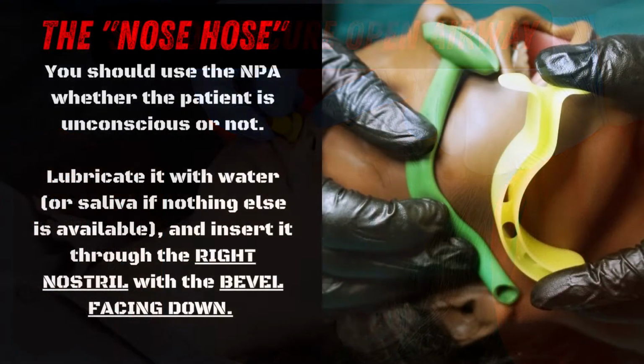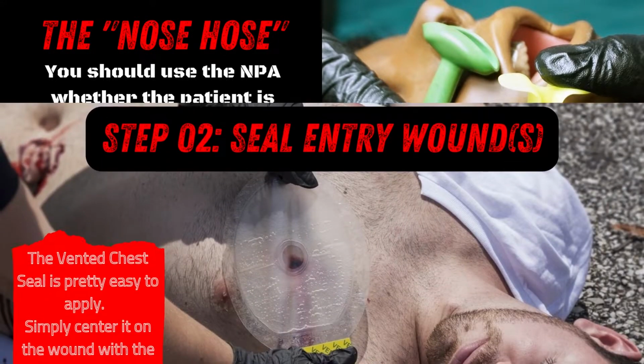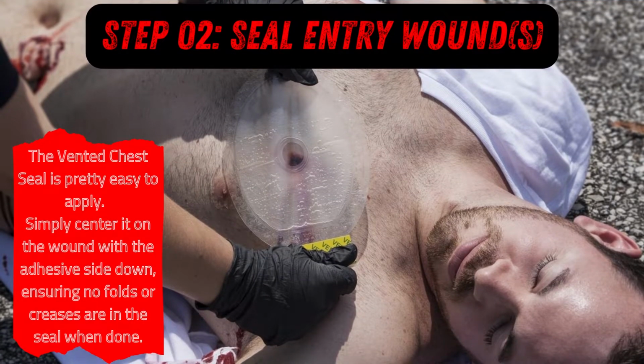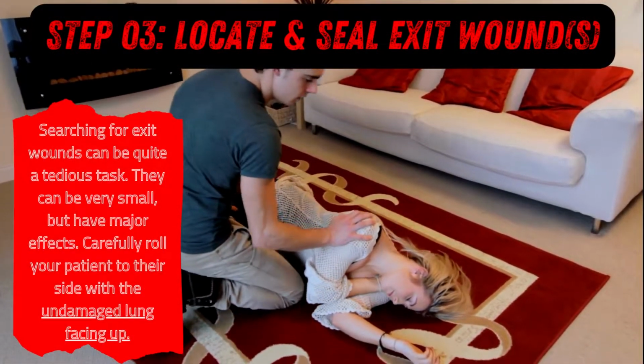Make sure to lubricate it and insert it through the right nostril with the bevel facing down. Step 2 is to seal entry wounds using the vented chest seal. It's pretty easy to apply. Simply place it with the adhesive side down, making sure that there are no folds or creases. Next, tilt the patient, keeping the undamaged lung facing up to search for exit wounds and seal them.